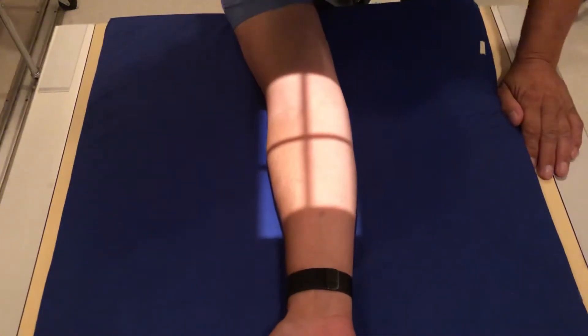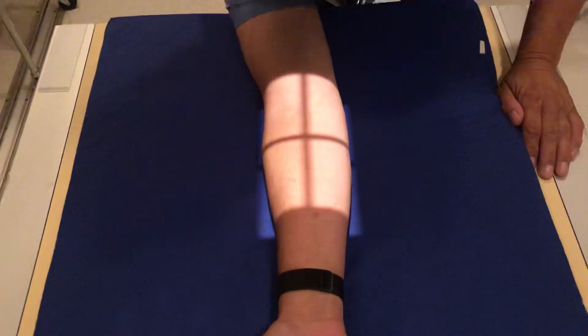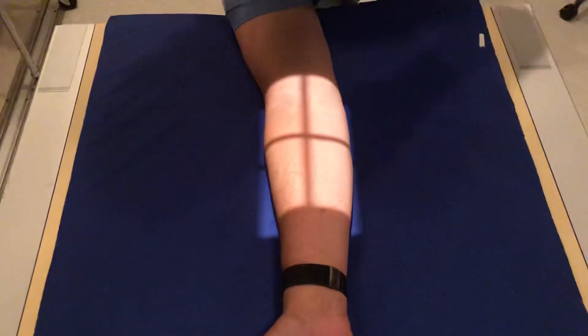All right, you clicked on this link because you want to know how to take an x-ray of the elbow, and I'm going to show you how to do it perfectly every time.